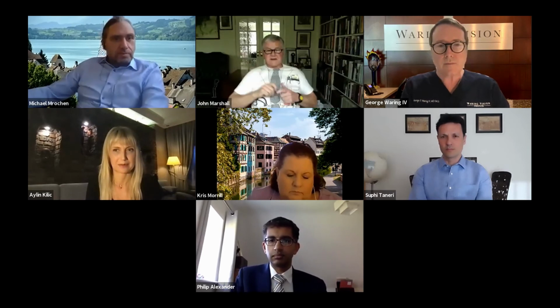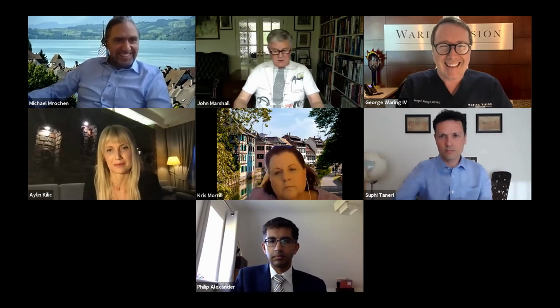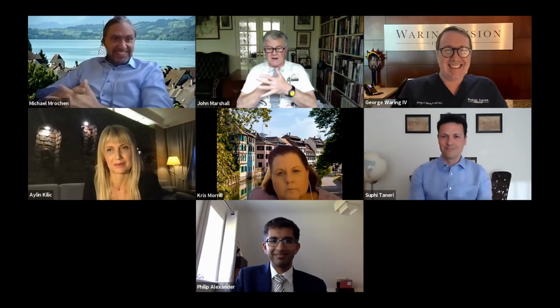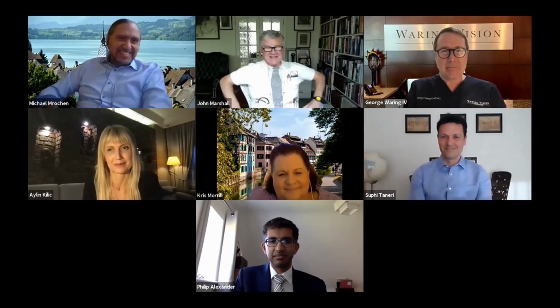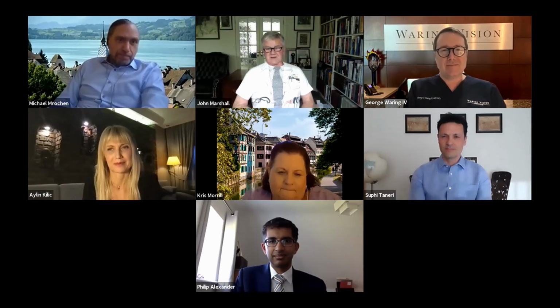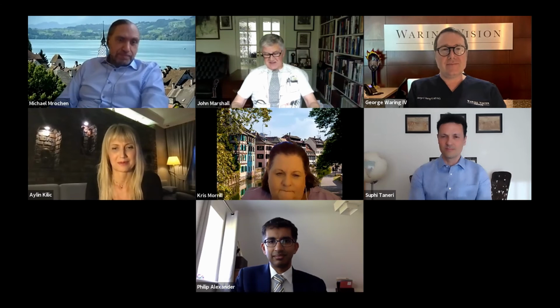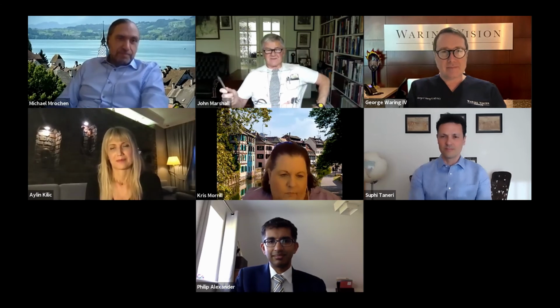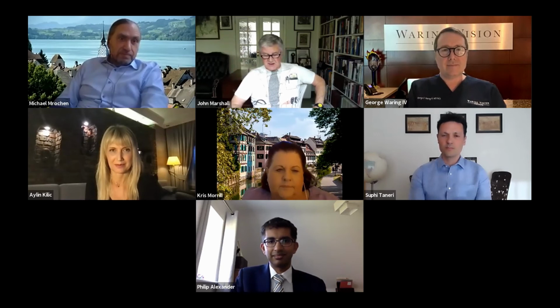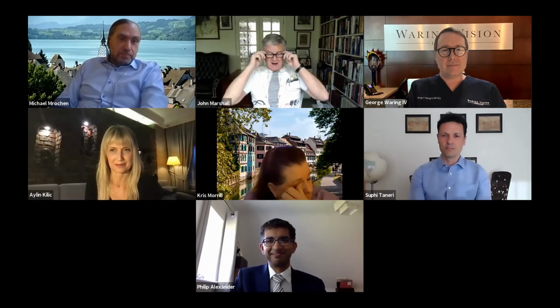As a long-term presbyope, I've never quite seen the point of constricting my pupils so that I can read the number plate of the car that I smash into. And so I have great difficulty understanding the logic of pupillary constriction. We all know that in any optical system, the smaller the aperture, the better the focus and definition. But I'm with Michael. I find this really very difficult forward movement. Commercially, it's terrific because you sell a lot of drops and a lot of people dribble the drops down their cheeks.